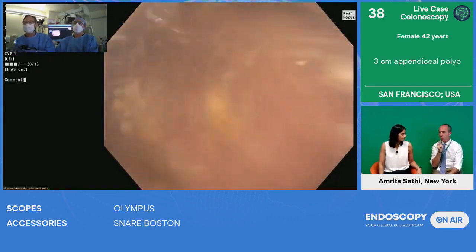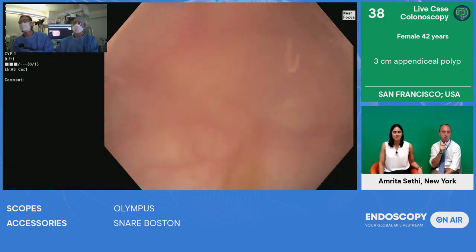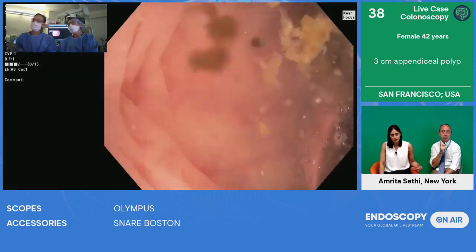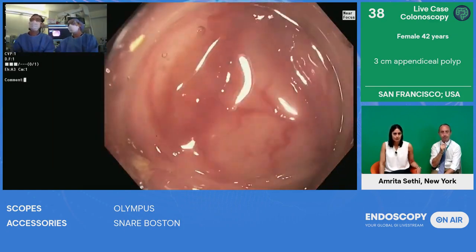All right, now Daniel, we have time for one question. We have time for a last question from Amrita. Yeah, so you've done a lot of work underwater, whether it be polypectomy, POEM. Do you have to change your settings? Do you have special settings for underwater work, or are they the same settings for a standard polypectomy?